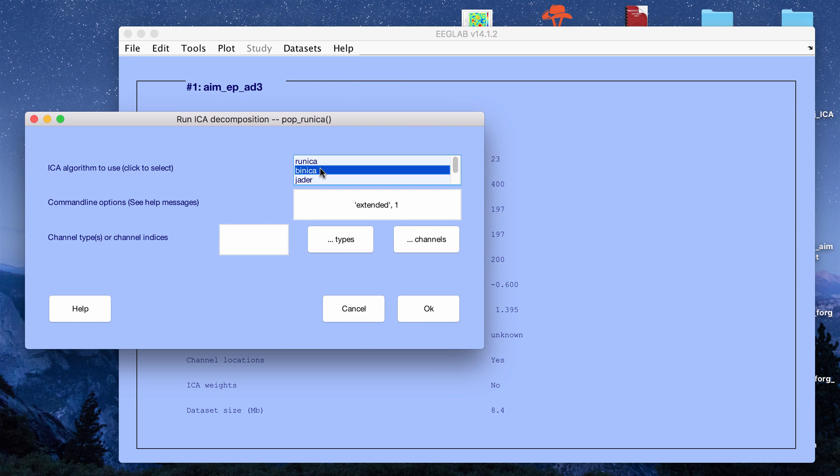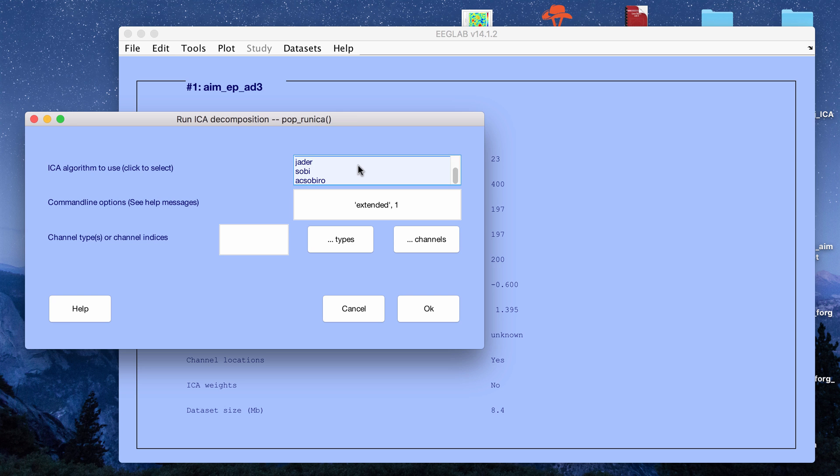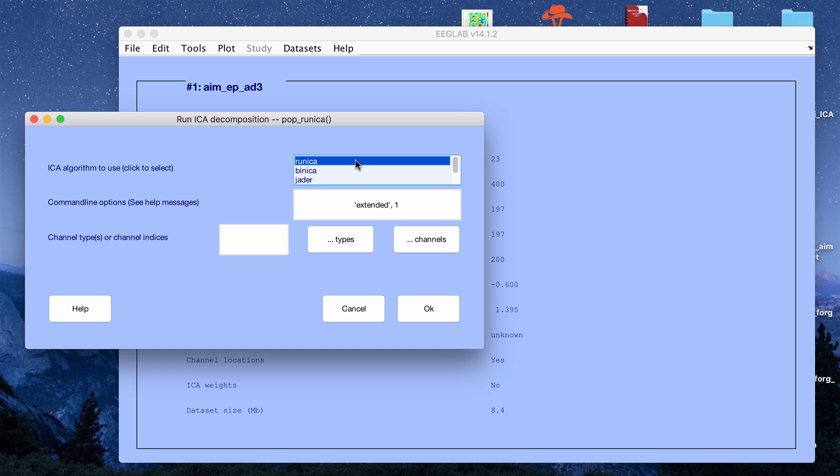There's another one called bin ICA. This is a binary file of the first one so it has the same algorithm and actually it will run faster. I've also read that basically these different ones all just usually give you the same components but you can run multiple ones and compare. I'm just going to run the first one called run ICA.